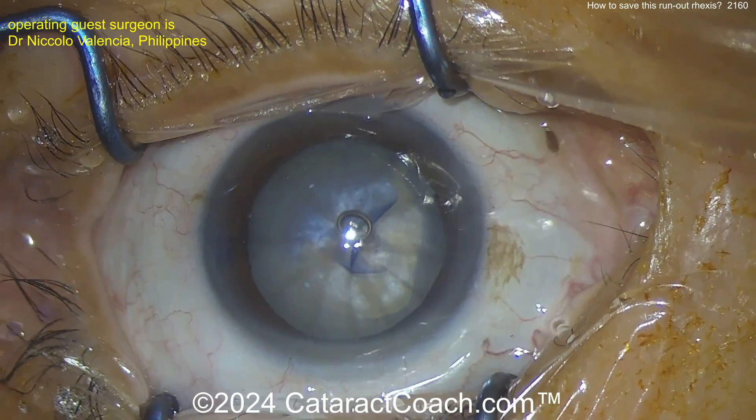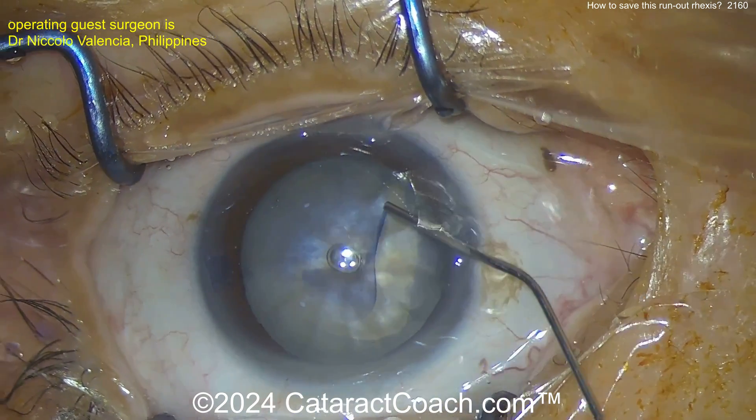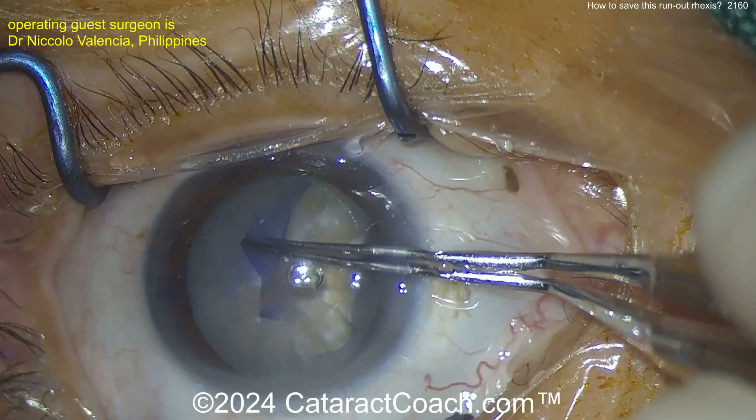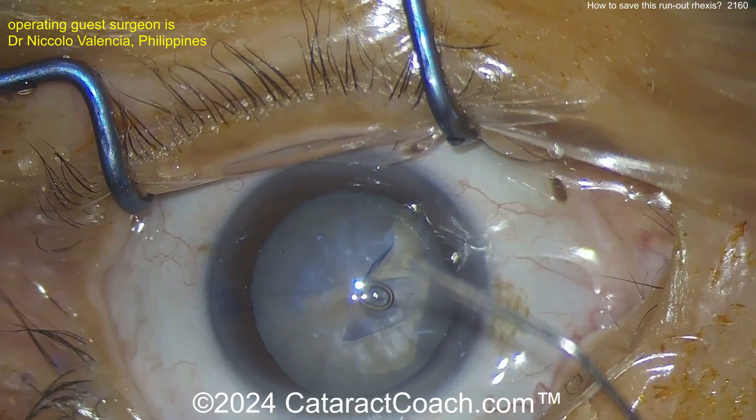There's the rhexis — and watch what happens right here. Oh, it runs out. It runs just like that, just that fast. So what could we have done earlier? Well, maybe a double rhexis technique: start with one small central baby rhexis, then really decompress the bag, and then continue.